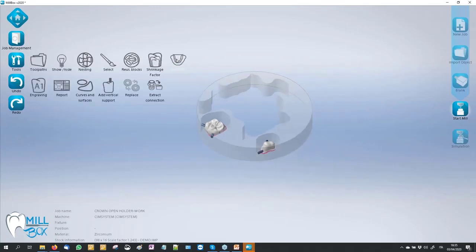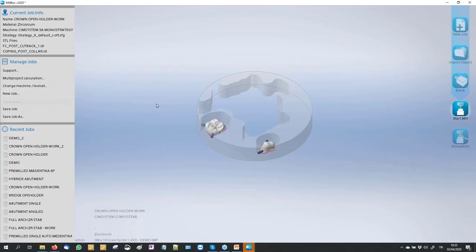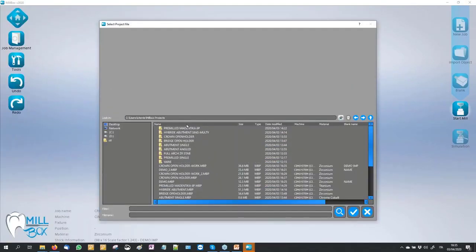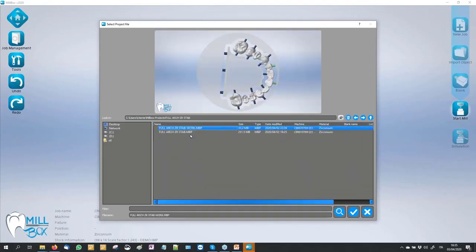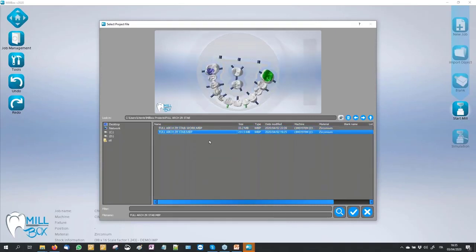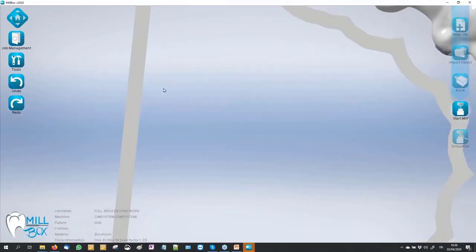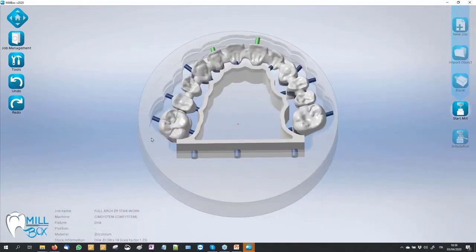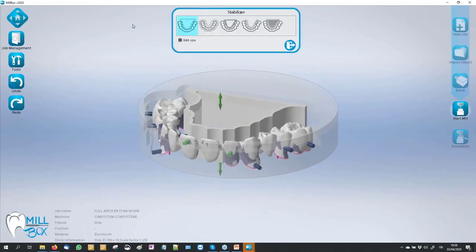The stabilizer — we have five shapes of different stabilizers. Let me open an example: Full Arch. I set this Full Arch job to show you our five different kinds of stabilizers.